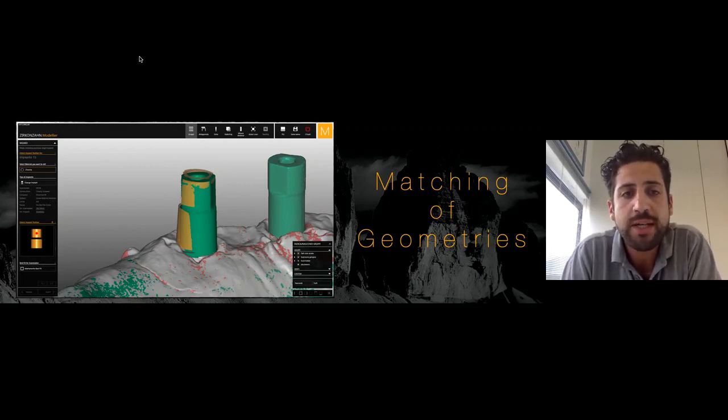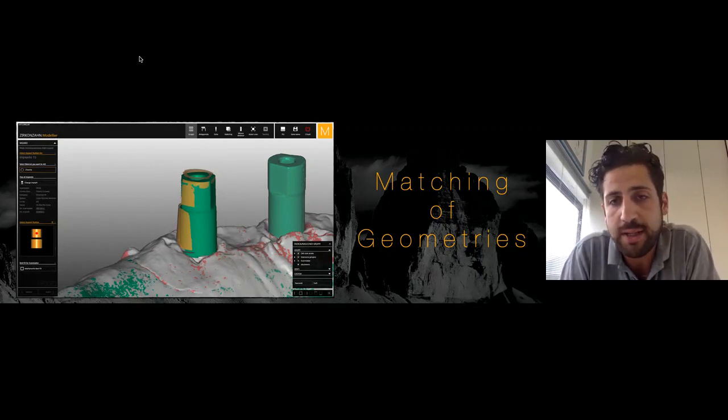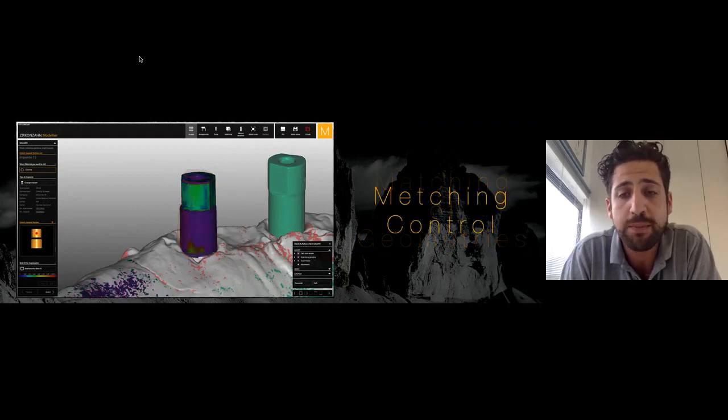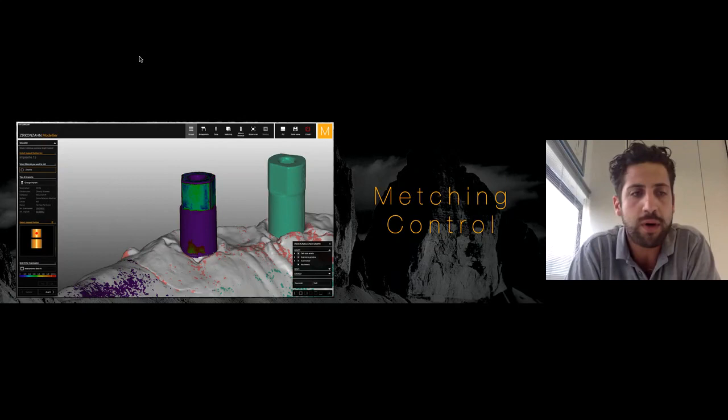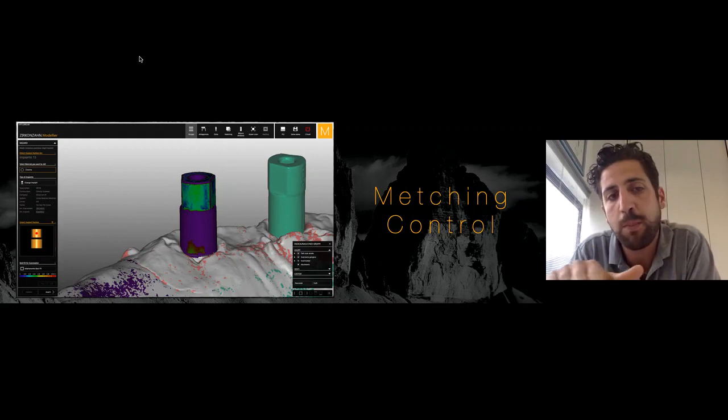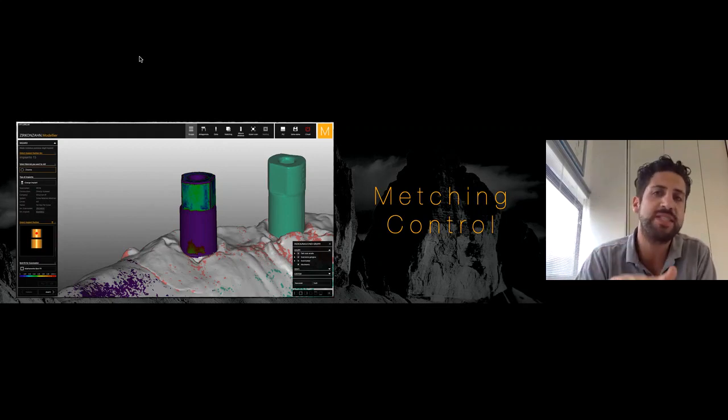It's really important to pay attention in this part because we have the possibility to make some mistake with the matching, and then our work will be wrong. We can see the nice matching just on the top of the connection of the scan marker. If the surface is completely blue, that means we have zero mistake between the two geometries.